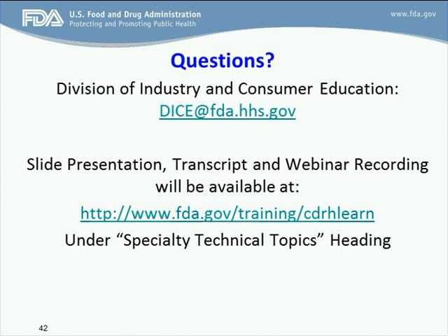That would be your second description, not the very last one, but basically we want to know that of the components that are in the soil, there's at least one test type that addresses each of those components. So for a particular clinical soil, you may have varying degrees of carbohydrates, proteins, lipids. We would like to see quantitative test data, for example, 1 for the protein, 1 for the carbohydrates, or if you wanted to include total organic carbon, however you decide on which those 2 are, the total of 2 is what we're looking for. Okay, thank you for the clarification.